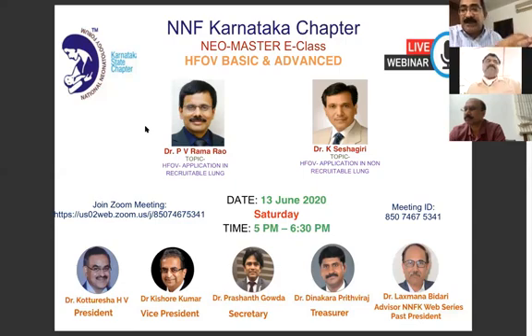Okay. So earlier instead of 1:2, what is physiology? It says 1:2. Now you want to do 1:1 ventilation. So 1:1, that is the IE ratio, or sometimes we use inverse also. This case means it's a very bad lung. Your back is against the wall. You don't have a choice.